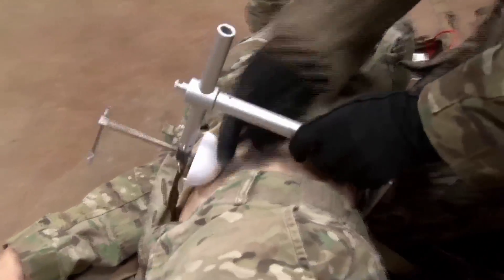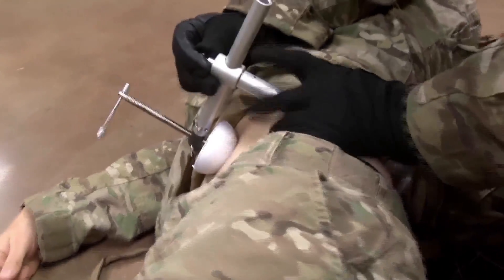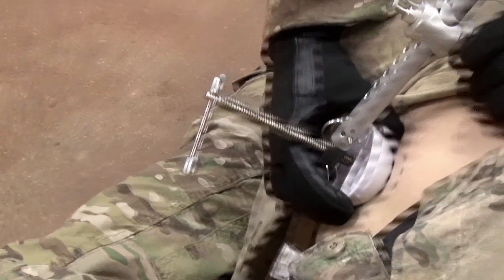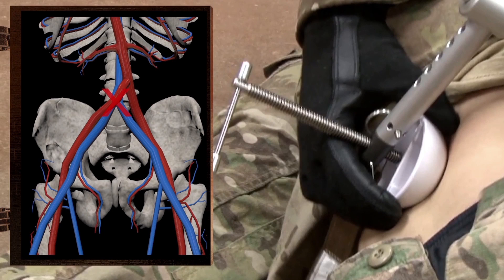For bilateral inguinal hemorrhage, or hemorrhage not controlled by distal pressure, as a last resort, pressure may be placed at the bifurcation of the abdominal aorta.